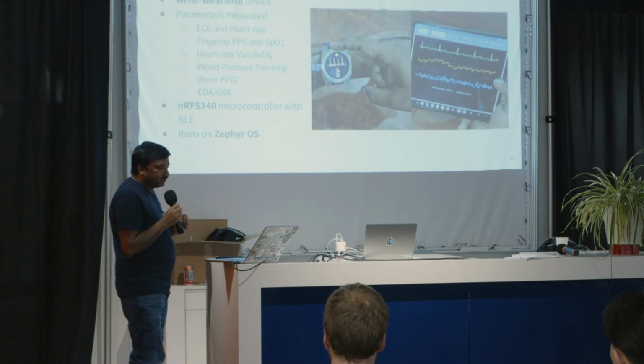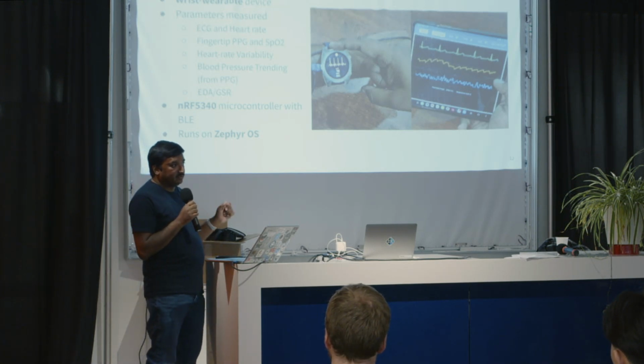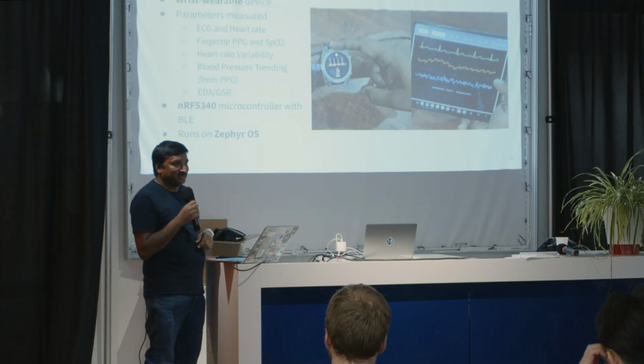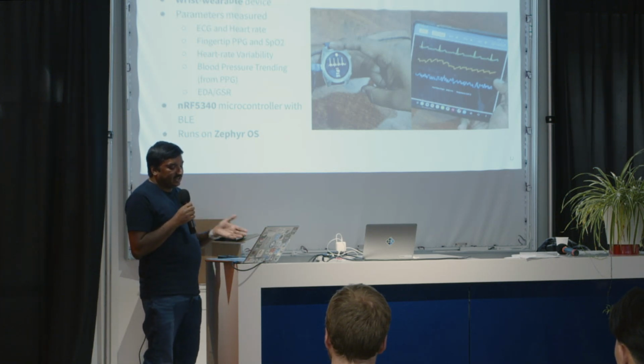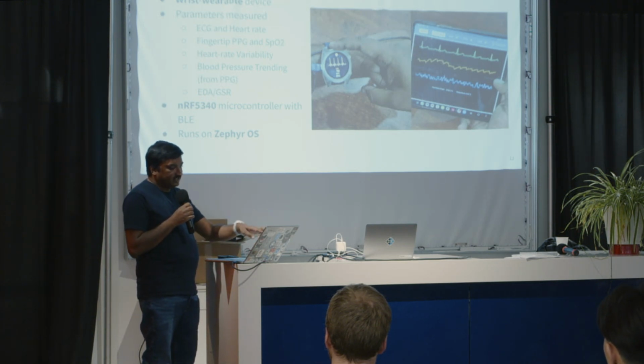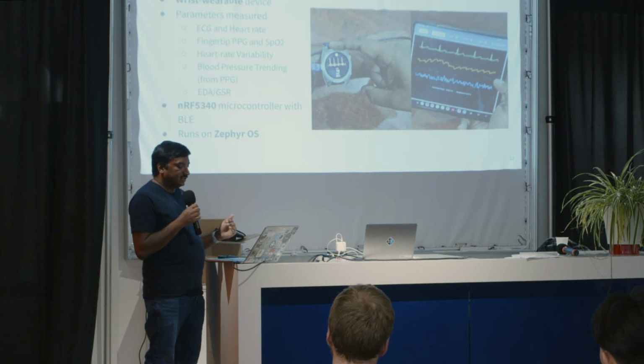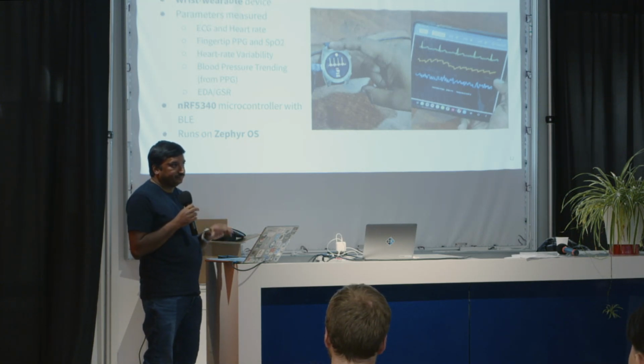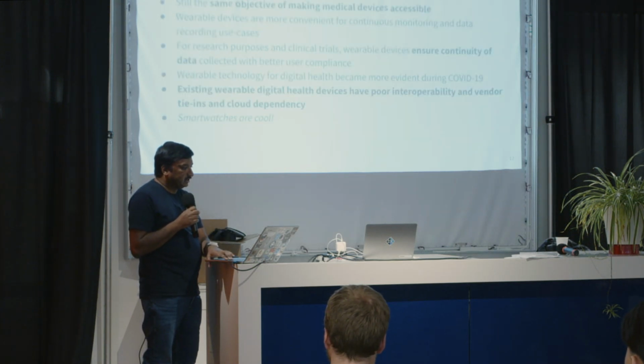So I just wanted to talk about why we made the HealthyPi Move, which is this watch that I'm wearing. I mean, it's not a watch; it's a patient monitor, right? I'll talk about why we went this way, but before that, we decided, first of all, it has to have the same parameters or more than what the HealthyPi 5 had. These are the current specs of the one, but I will just go through each one.